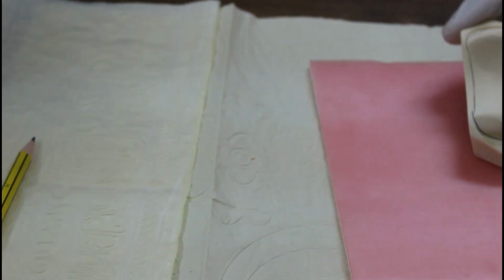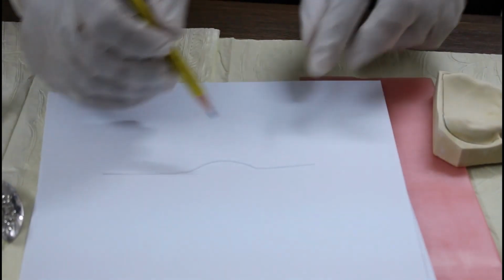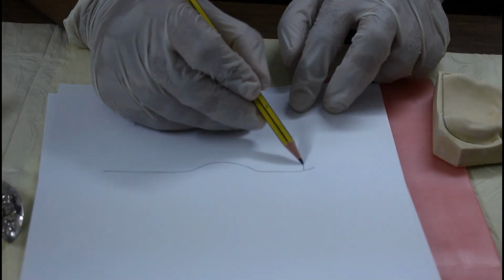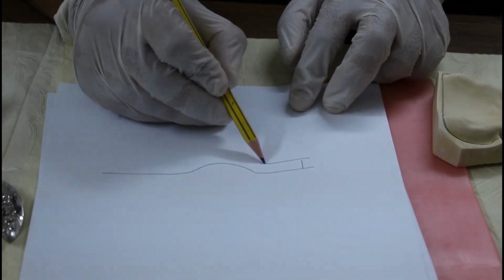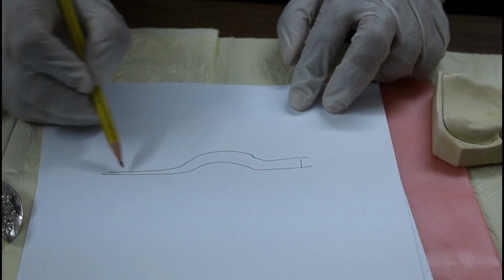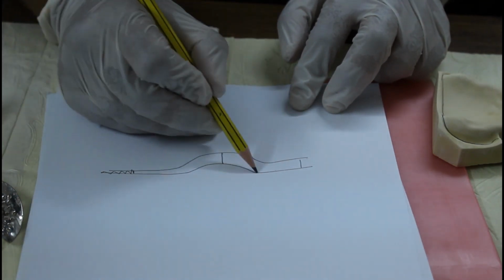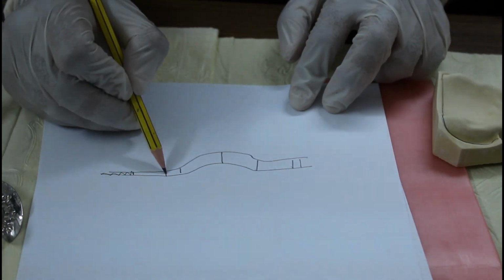We draw a line. This is the frenum going up like this. This is the first line. Now when we are drawing a line 2 millimeters above, it should go up if there is a frenum. It should go down wherever the line is going down. There should not be uneven markings. It should be 2 millimeters everywhere.